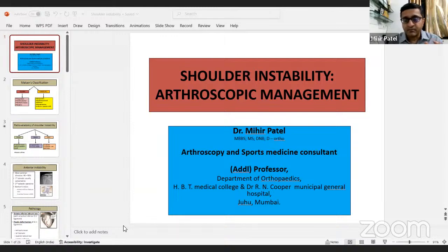And I think, you know, your point where you touched upon the normal variance is extremely important, because what happens is, as beginners, when we see a little labral separation from the glenoid, specifically when you're looking at a Buford complex or a sublabral foramen, you'll be very excited to put an anchor there, and you realize that the patient has completely lost his external rotation.